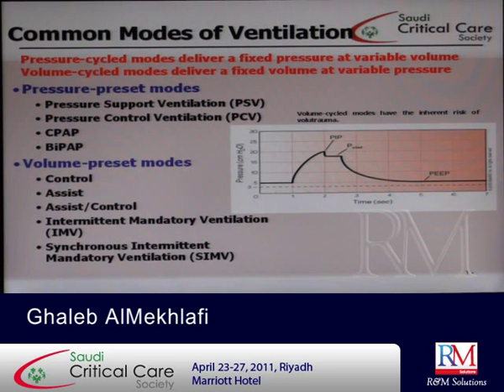It is either pressure cycled or volume cycled. What do we mean by that? In pressure cycled modes, it delivers fixed pressure at variable volume, and in volume cycled modes it delivers a fixed volume and at variable pressure. We'll talk about that and explain it.